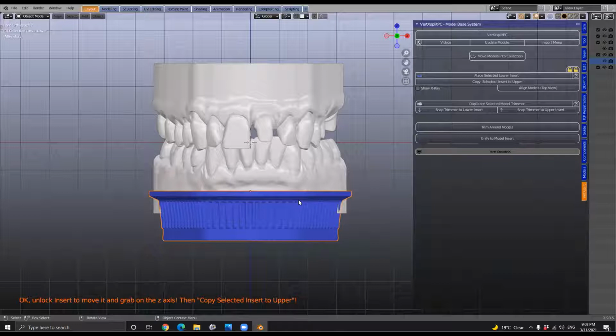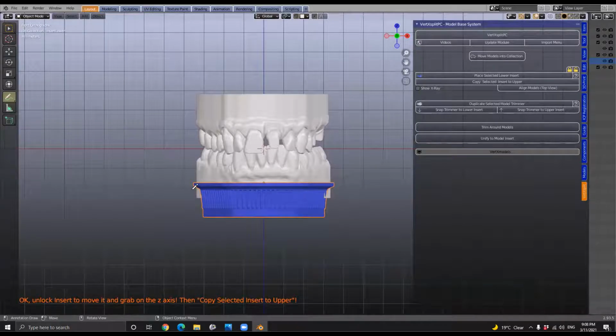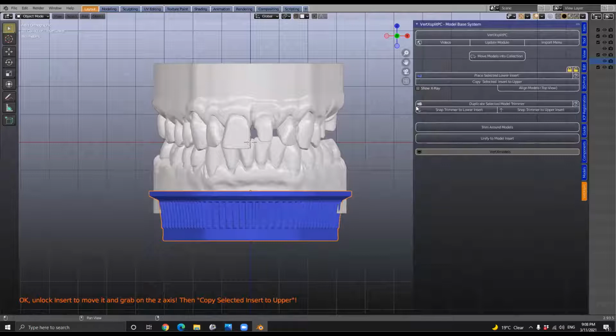Yeah, so the plan is, and this is still in development, this plastic injection model base will have another component to it. We call that the articulator mounting plate. The articulator mounting plate stays on your articulator, and it has a magnet system with this base. By putting it down below the horizontal, the upper one, which Michael will show in a minute, will also come into that same position, but the inverse. So if you have it 20 millimeters below the horizontal, the upper one will also go 20 mils above the horizontal. In so doing, you can then lock in that position for any patient, any articulation, and so on. But we'll get to that in a minute.